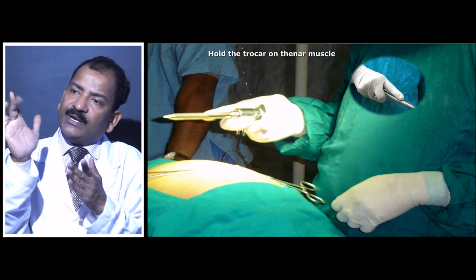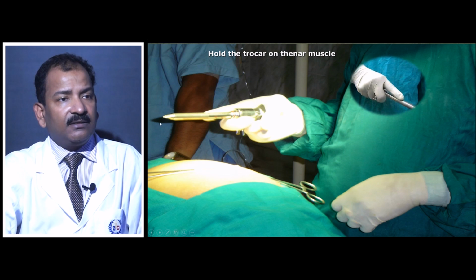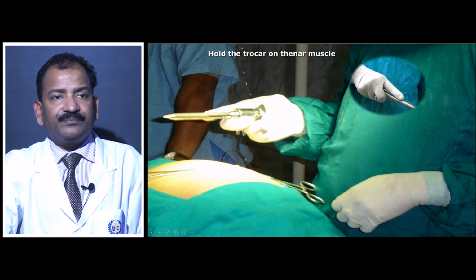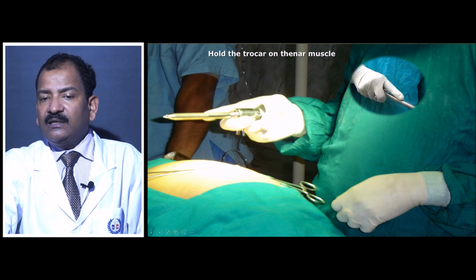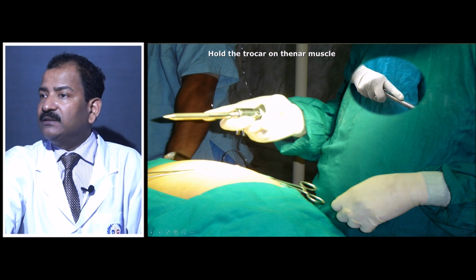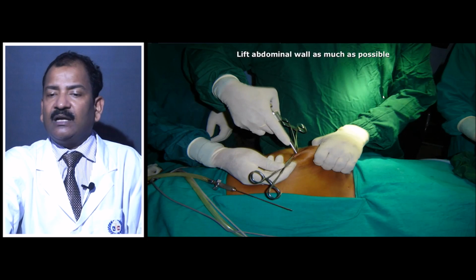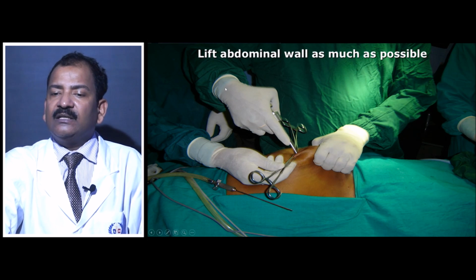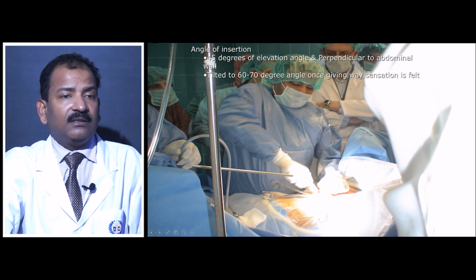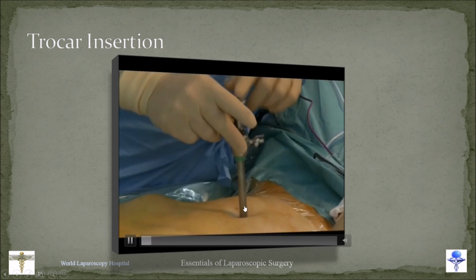Hold the trocar like a pistol, head of the trocar should rest over the thenar eminence, middle finger should wrap around the air inlet and index finger should be pointed towards the sharp end. Cannula has two finishes, this is dull finish, this is shiny finish. Dull finish is inside the abdomen because it will not reflect the light. Your index finger must reach up to half of the dull finish of the cannula, and then slowly you will enter into the abdominal wall by rotatory movement, screwing it. Only thing to be taken care of is that screwing should be perpendicular to the abdominal wall.